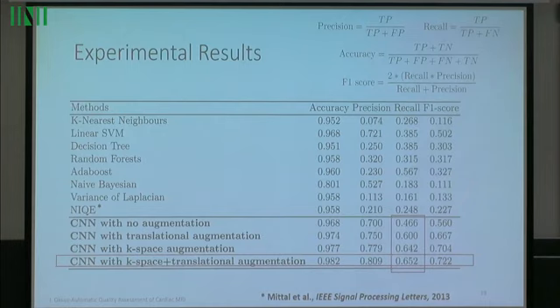The experimental results show that the CNN-based architecture is capable of identifying the presence of motion artifacts with high accuracy. But as you see, all methods are giving high accuracy due to the highly imbalanced nature of the problem. Here, the recall results are more telling, which underline the number of true positives in the classification performance.